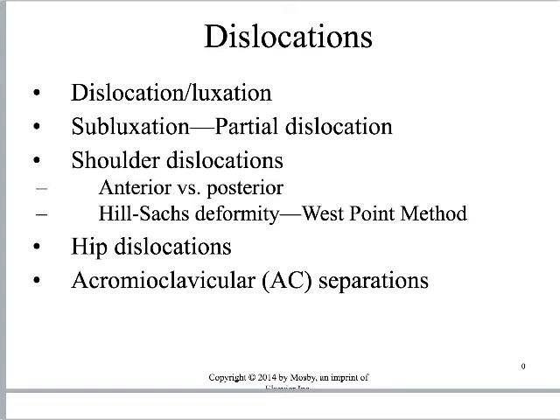And it is, I don't know, satisfying to be in the room when a patient has their shoulder placed back in socket. You just watch this wave of relief across their face. It's pretty remarkable. But we are helping the physician to make a determination whether it's an anterior or posterior dislocation, because that influences the technique that they'll use for relocation. They have a couple of different twists that they can do.